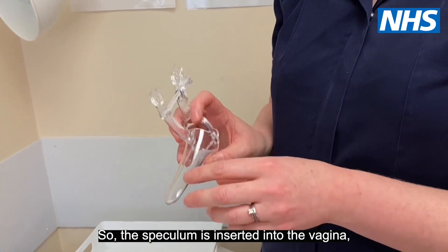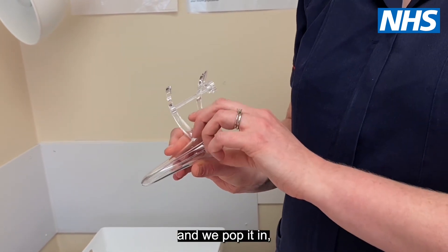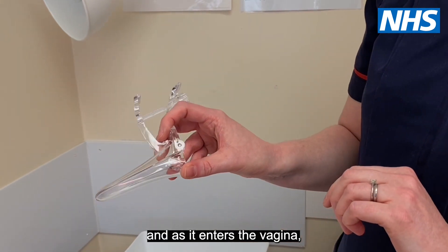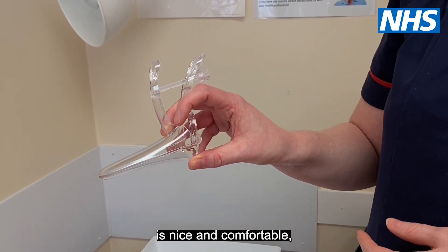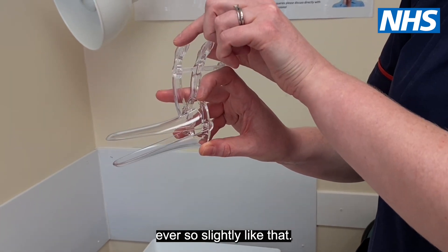The speculum is inserted into the vagina, usually popped in at a slight angle. As it enters the vagina we turn it straight, making sure that the patient is nice and comfortable.